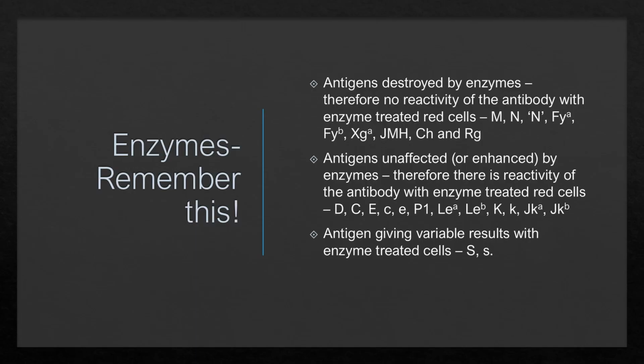Remember which antigens are destroyed by enzymes and which antigens are unaffected or enhanced. Remember, the ones that are destroyed by enzymes, you cannot use those for antibody rule-outs. And big S and little s do give variable results with enzyme-treated cells.